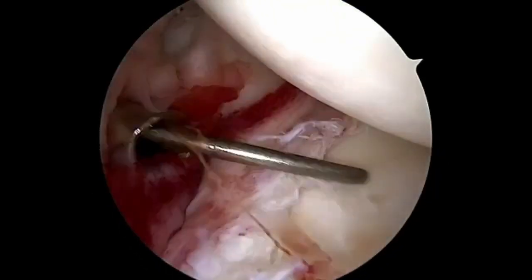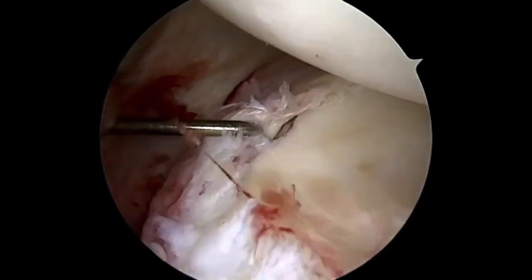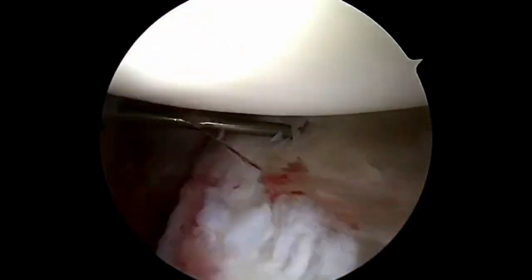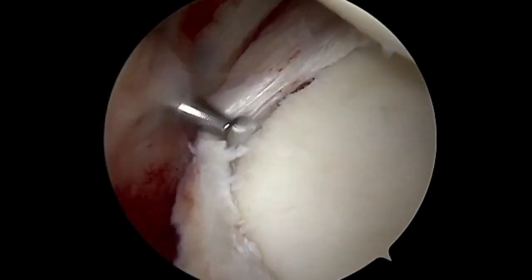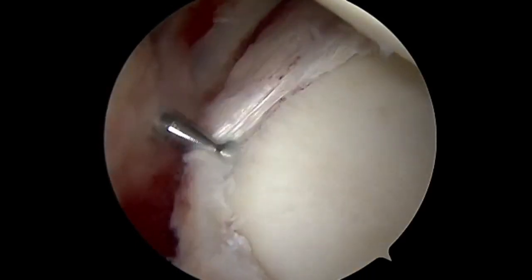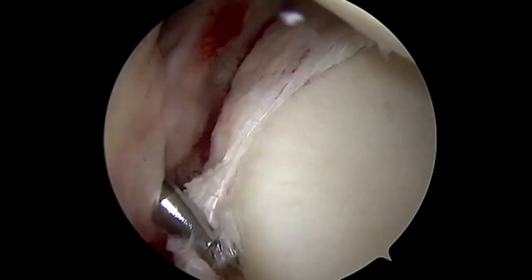Then we're going to place the scope back in the anterior portal and visualize the tear. This was an extensive tear involving the entire posterior labrum. Using a shaver and burr, we're going to prepare the glenoid rim to bleeding bone to stimulate a repair response.